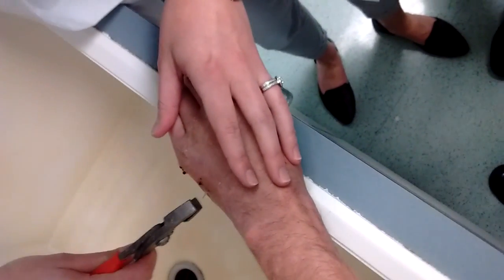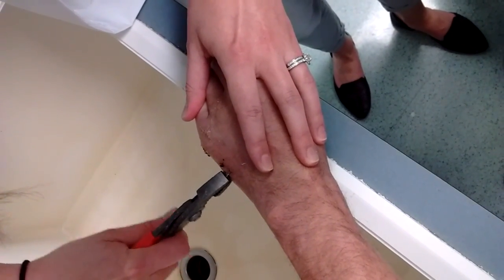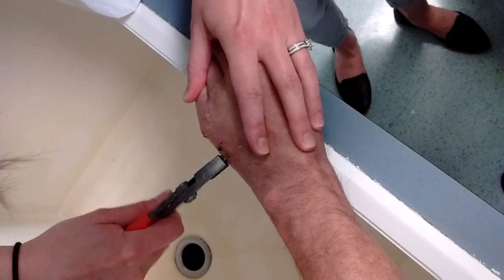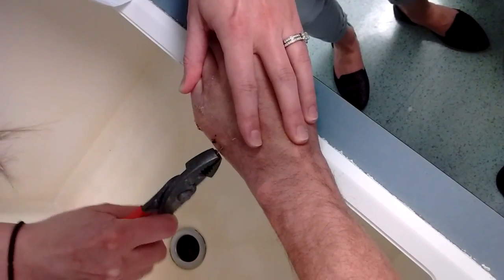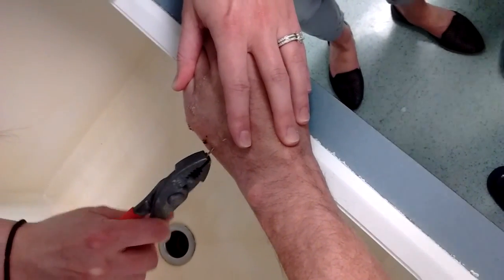Those things are kind of bigger than I thought — they go wherever to here. They kind of transfix the two bones. You'll definitely feel more resistance on this one because it's cortical, but it'll come. And it's coming, just a little bit more. And I'll get to wash you up.